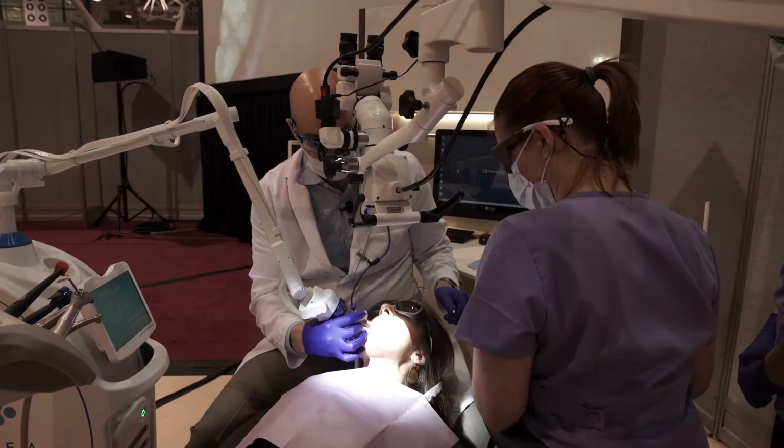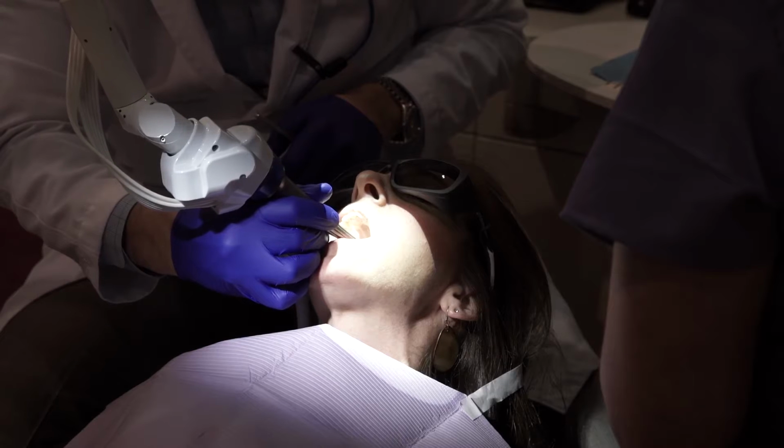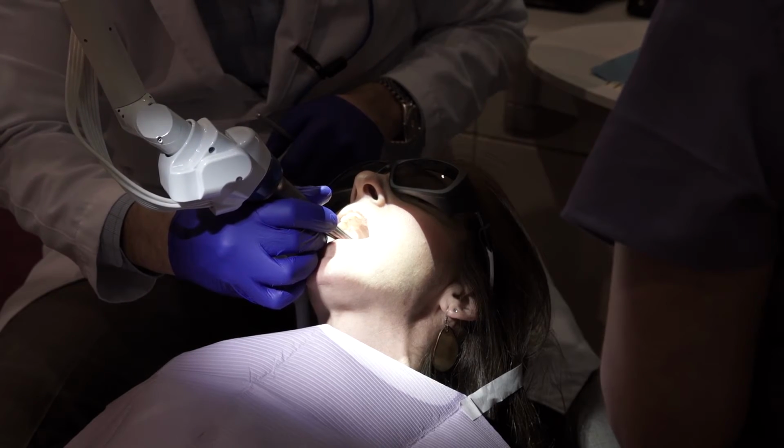Well, it kind of depends. The laser that we were demoing this morning was Solea. It's a CO2 9.3 micron wavelength laser, and it's effective on teeth, bones, and soft tissue. So there's no question that for teeth, we're doing reliably anesthesia-free dentistry. But it'll cut bone, and so when are we going to do a little bit of local anesthetic? Chances are the deeper I go, if I'm already doing an extraction, I might use Solea to trough around to get a root tip out, but they probably already have some numbing on board for that.